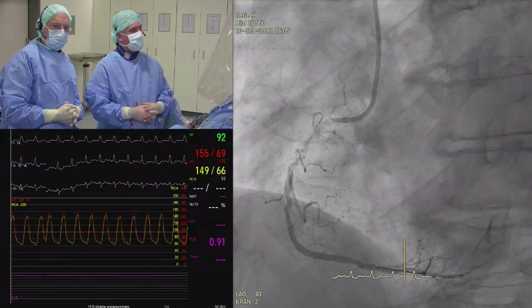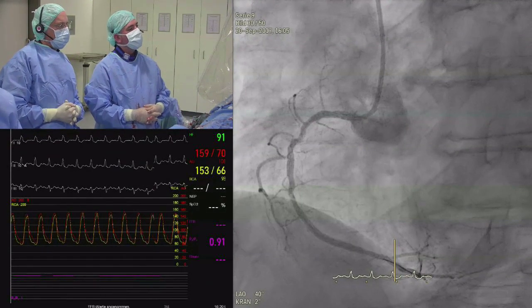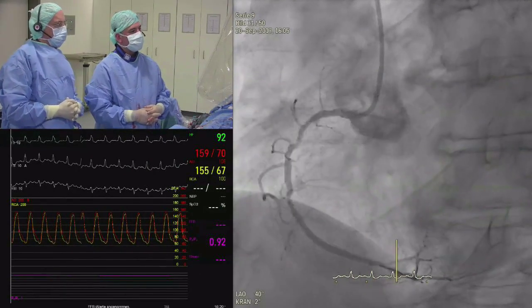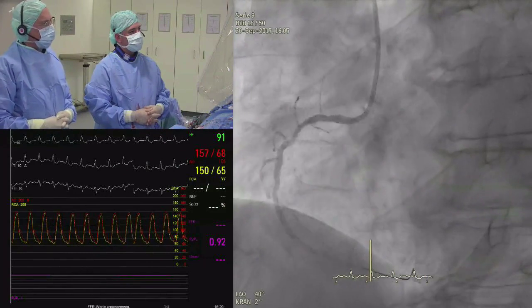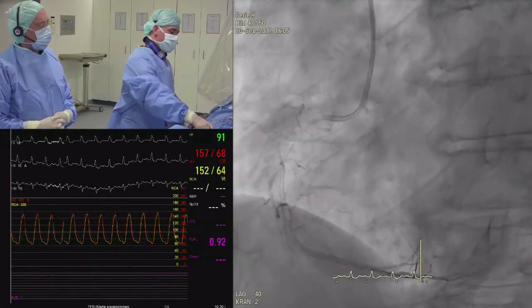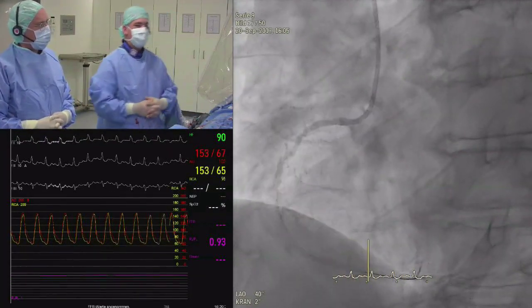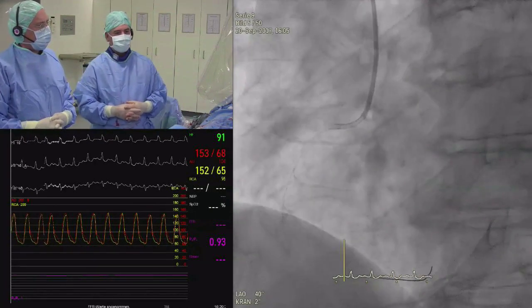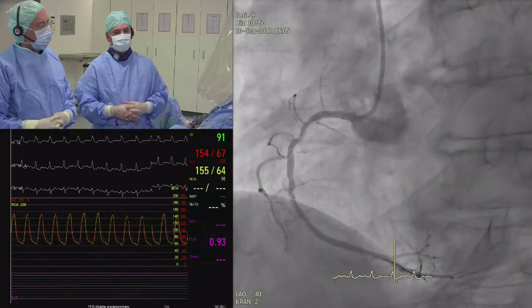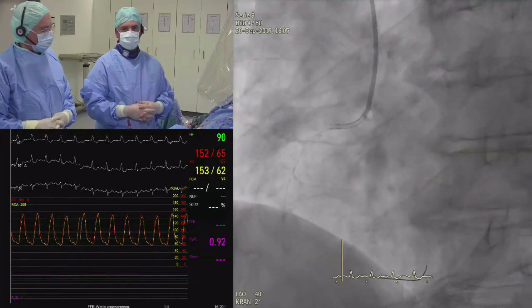Yeah, okay. Looks okay. It seems to be an okay plan. The only thing is that you're going to be stenting from proximal to distal, which is against conventional interventional wisdom. But I think sometimes less is more, and by not touching the distal lesion, the patient may fare the same. And if we go back to the pullback, I think most of the gradient was caused by the proximal lesion, and as a rule of thumb, a more distal lesion has much more of an effect on the more proximal one, and vice versa. So I wouldn't expect too much of a change in terms of the distal lesion, in terms of gradients after stenting the proximal.